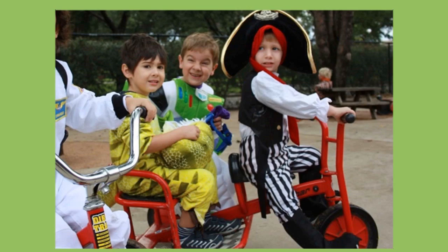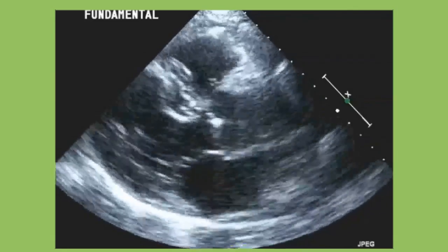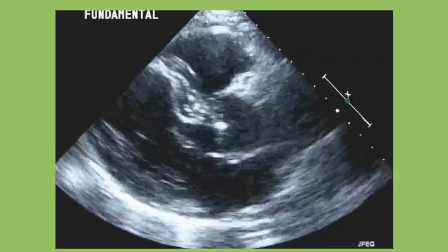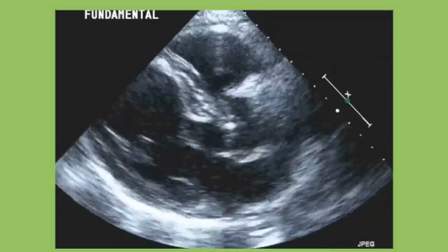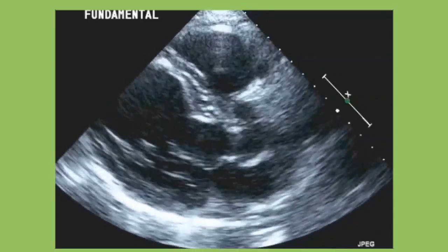They are not flexing the muscle, but if this was a movie, you would actually see them moving, although they're doing nothing. So you may be wondering why Dr. Plana is showing this image. Because as you see over here, this is exactly the same challenge that we have when we are trying to adjudicate regional function.